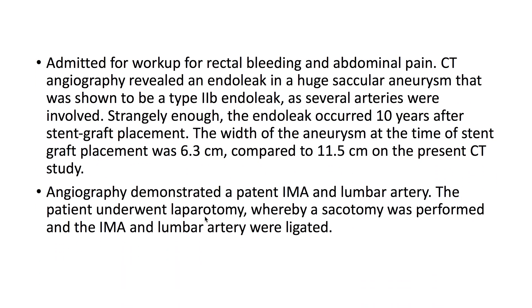This patient was admitted for workup of rectal bleeding and abdominal pain. CT angiography revealed an endoleak and a huge saccular aneurysm, shown to be a Type 2b endoleak as several arteries were involved. Notably, the endoleak occurred 10 years after stent graft placement. The width of the aneurysm at the time of stent graft placement was 6.3 centimeters, compared to 11.5 centimeters on the present CT study. Angiography demonstrated a patent IMA and a lumbar artery.